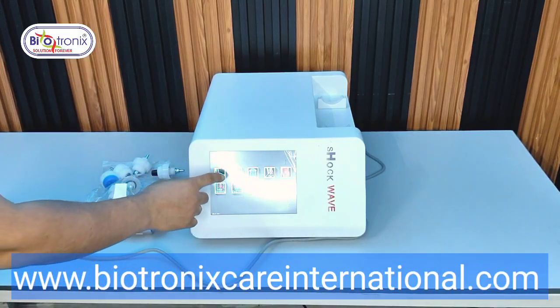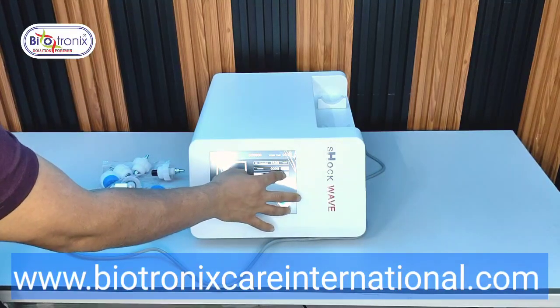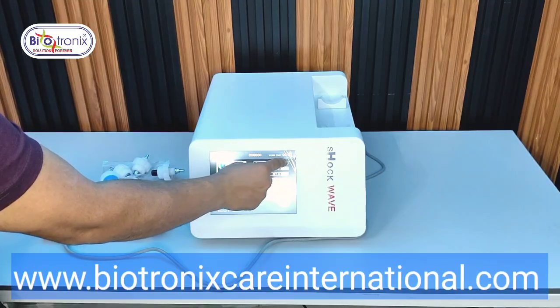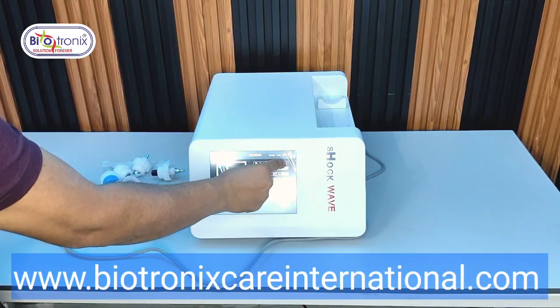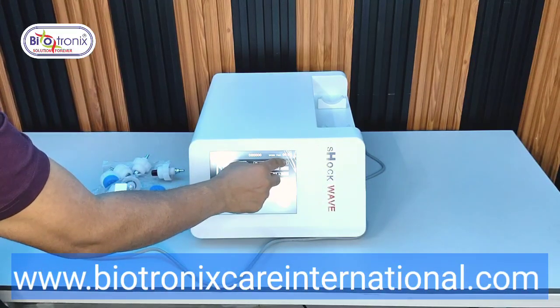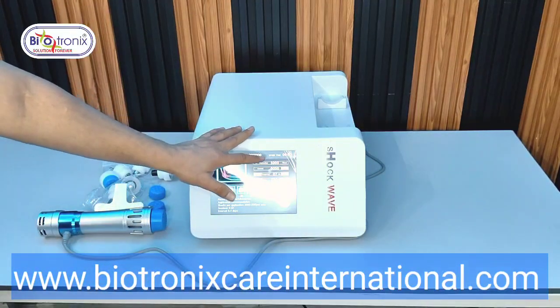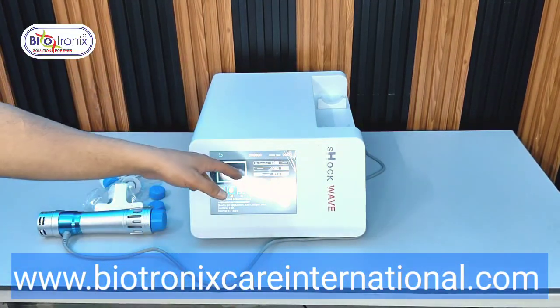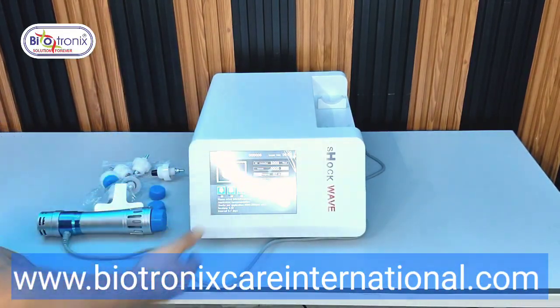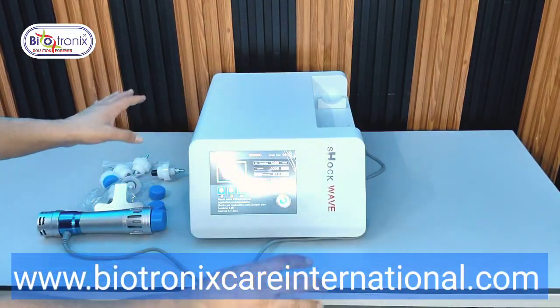So now you can see if I select the elbow, the frequency I can go from 1 to 16, and these are the pre-selection shots. You can vary the same. You can go up to 5000. So this is the pre-selection. Like I have selected 5000 shots, and when I start the treatment, it will keep on counting the shots and give you the number. Once it reaches 5000, the program will automatically stop, the treatment will automatically stop.